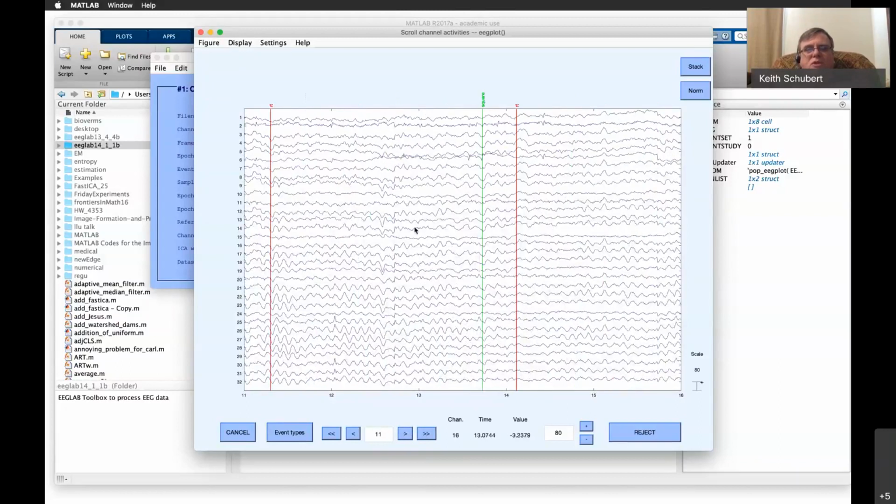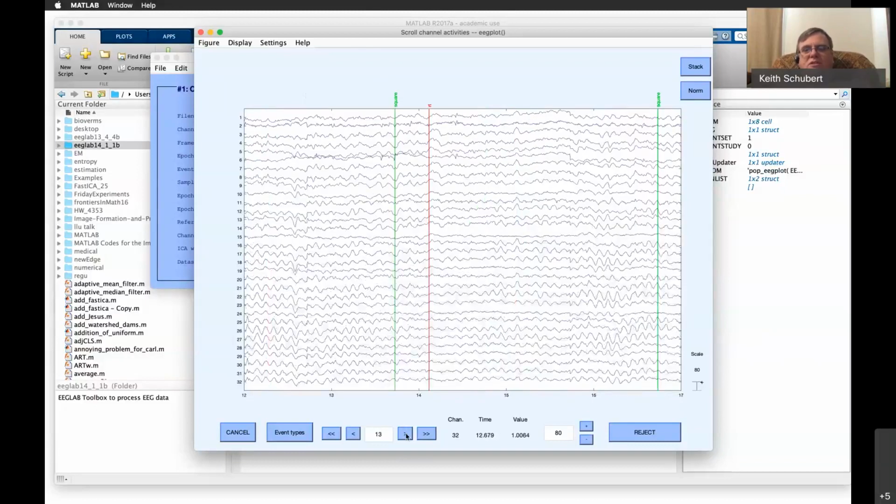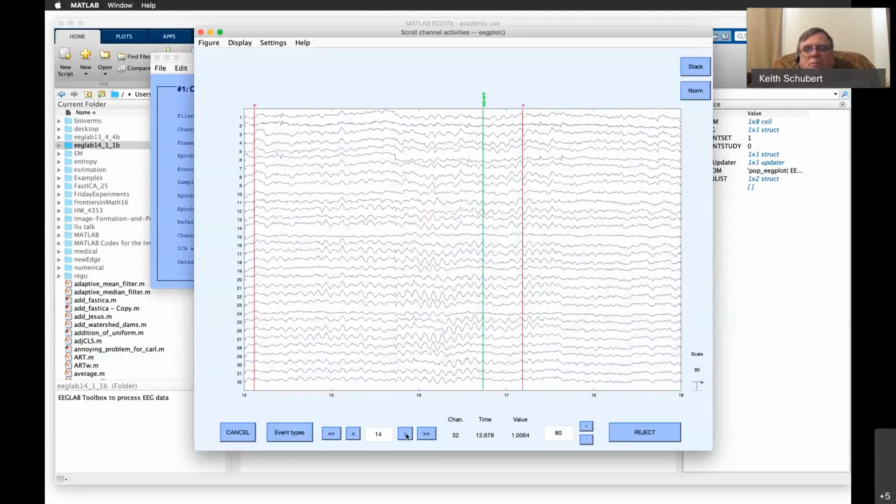The other thing I'm looking at is that usually your eye channels tend to be towards the top of this. Not guaranteed, but usually people start numbering in the front and move back. So I'd presume one of these is pretty close to where the eye is. The eye channels usually tend to have strong blink artifacts, and those are fun stuff to remove. I haven't used this data set in 2 years, so I don't remember if the blink artifacts have been removed from it or not.